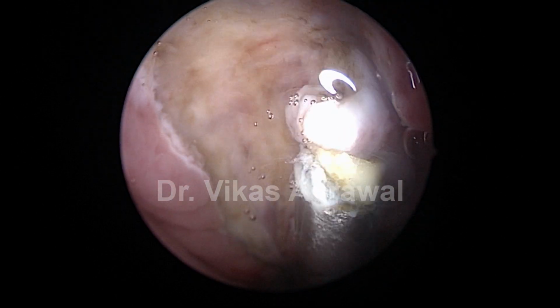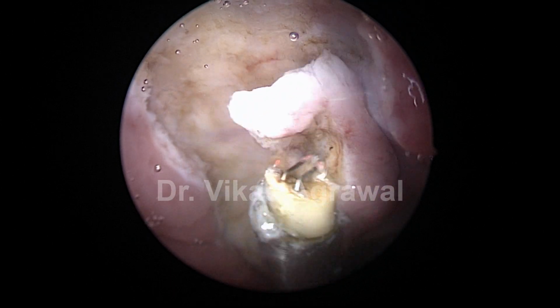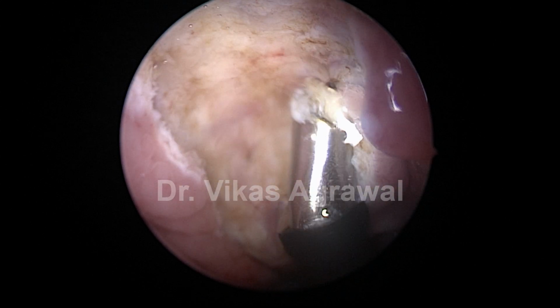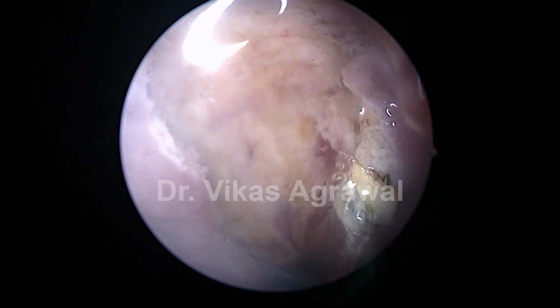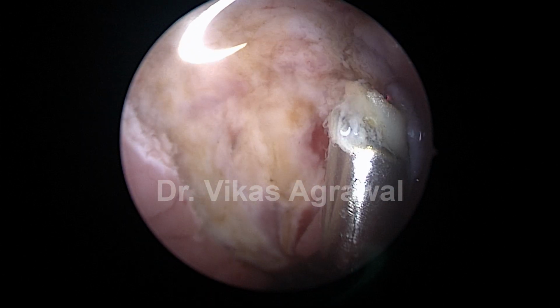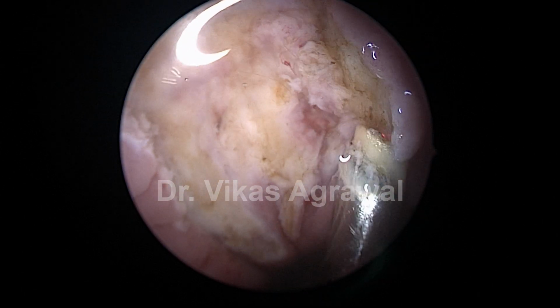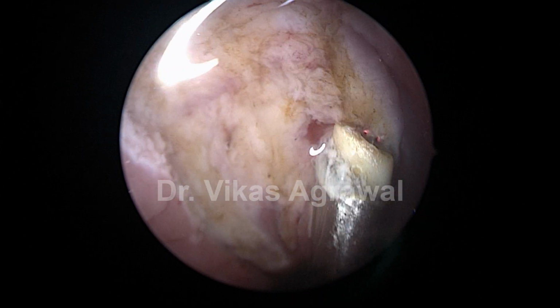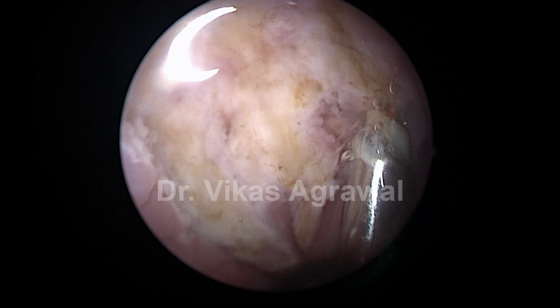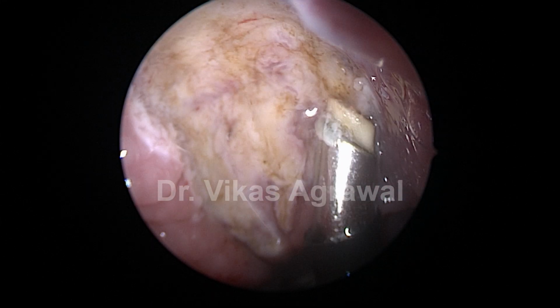And now you can see this wand, one of the wires is already exhausted because we are ablating at a very high speed. So one of the wires is already exhausted, and that means that I will have to open another wand to complete this surgery because this wand was already utilized for his tonsils, which are grade 4. So that also required a lot of ablation, and that resulted in the consumption of the wand.